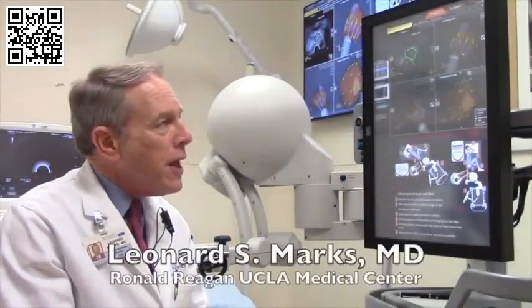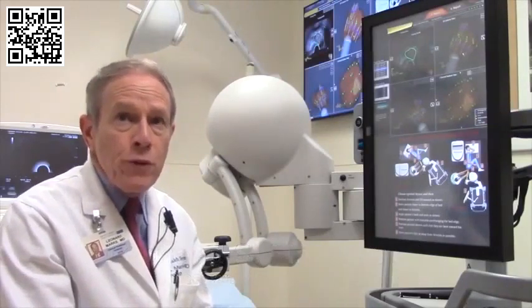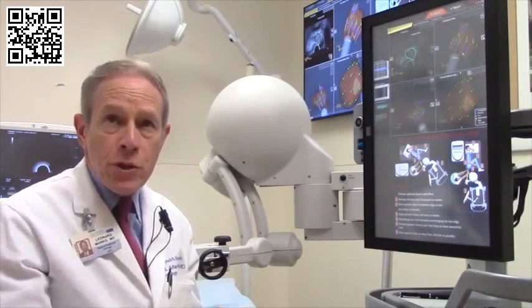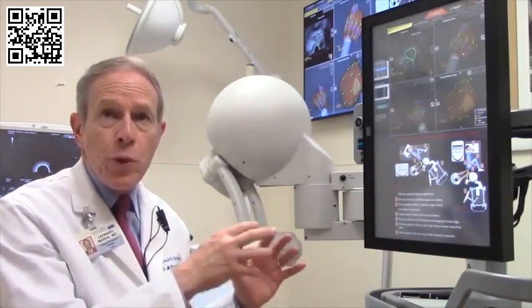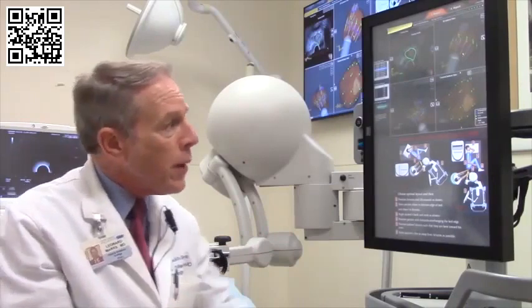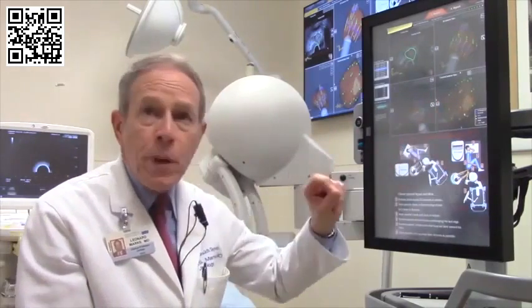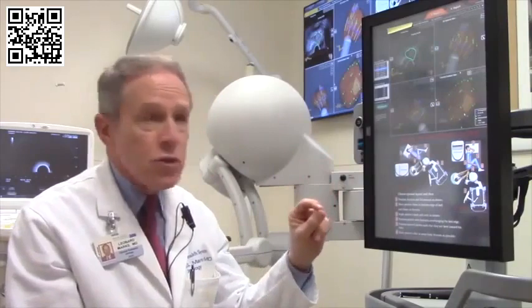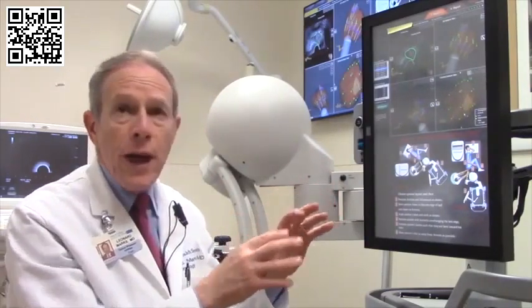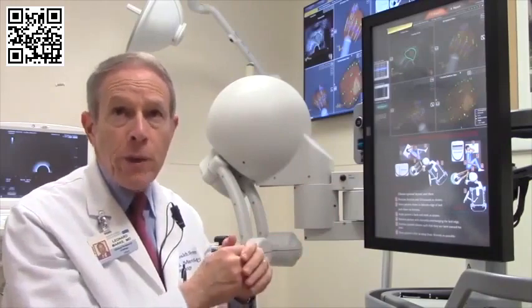This is a device which allows image fusion, real-time image fusion. It allows us to bring stored MRI images into a clinic setting and fuse them with real-time ultrasound. The purpose of this is to allow spots in the prostate, which are suspicious, regions of interest we call them, to serve as a target for a targeted prostate biopsy.